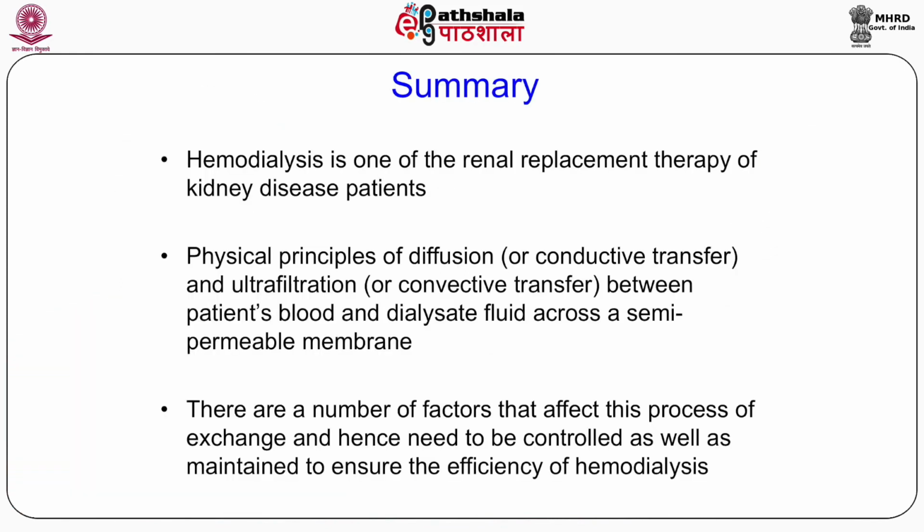So with this, we will summarize what we have discussed in today's module. First, hemodialysis is one of the renal replacement therapies which takes care of the first two functions of the kidney that we discussed: removal of waste products as well as water and electrolyte balance. Then we discussed the physical processes of diffusion, ultra-filtration, and the concept of semi-permeable membrane in solutions, which form the physical basis of the process of hemodialysis.